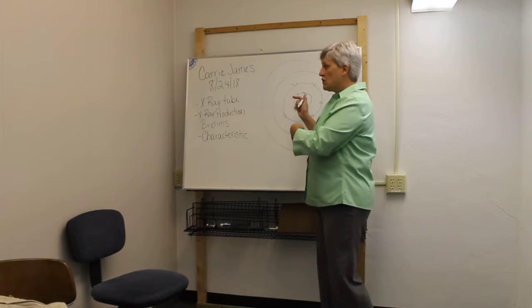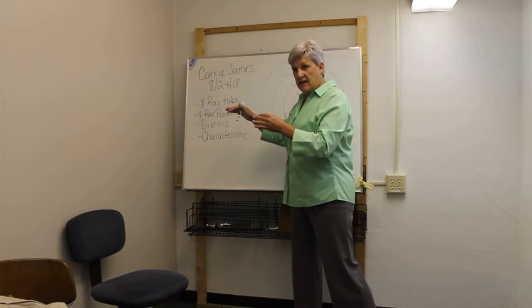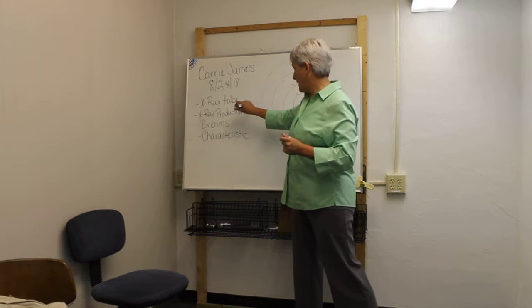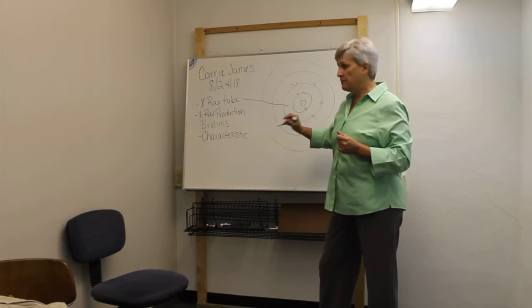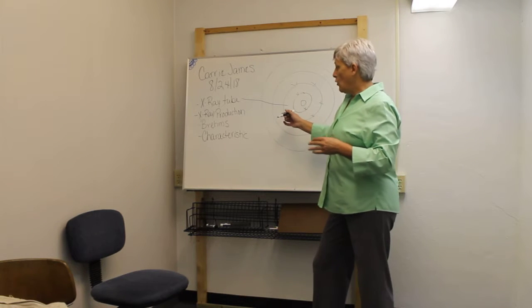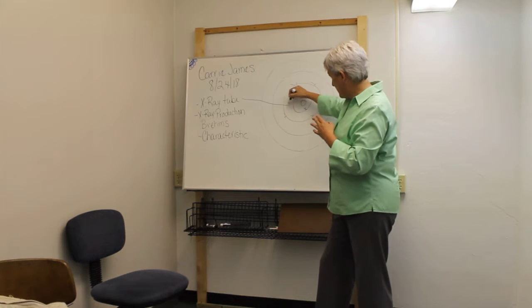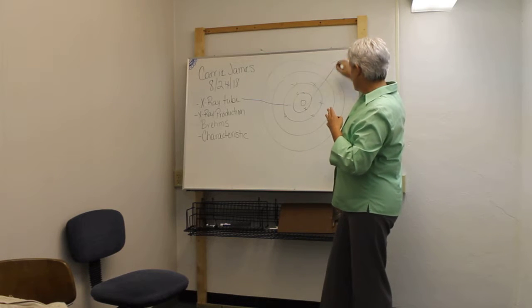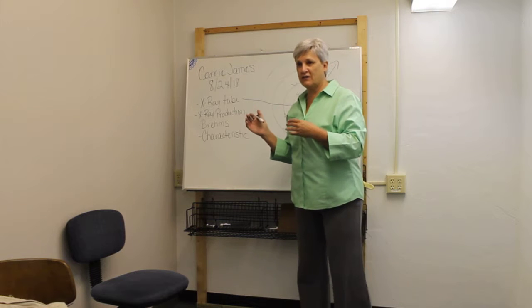When we're producing electrons at the cathode side, we then energize the anode side and cause these electrons to come across, and they're going to interact with those tungsten atoms. If this electron comes in, breaks and goes another way, this is called Bremsstrahlung. It's interacting with the nucleus of the atom.